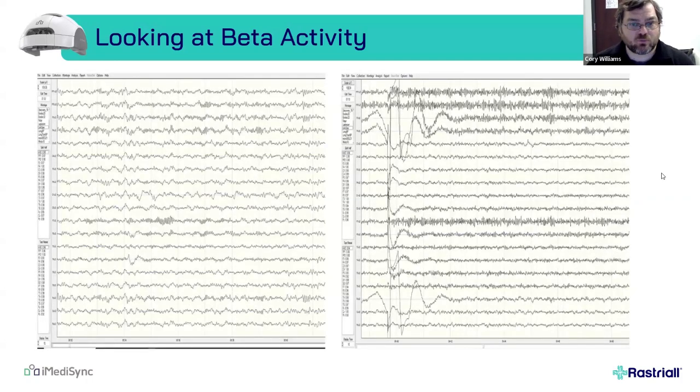But when we look at the raw signal, the one on the left shows us cortical beta activity. That's beta coming from the brain. It's known as excessive spindling beta. It's common in oppositional defiance. It's common in sleep disorders, insomnia, in scattered focus, attention, anxiety. It's a pathological presentation.